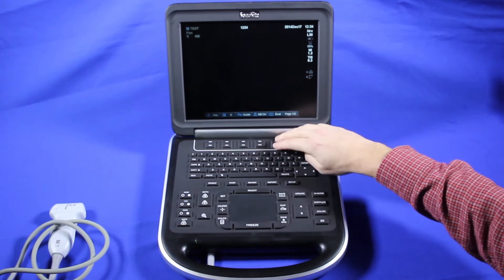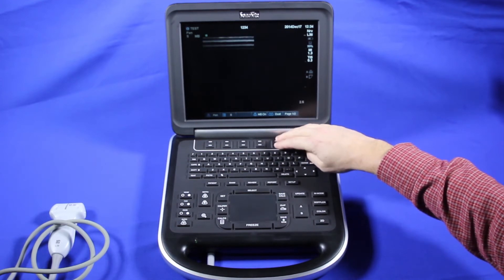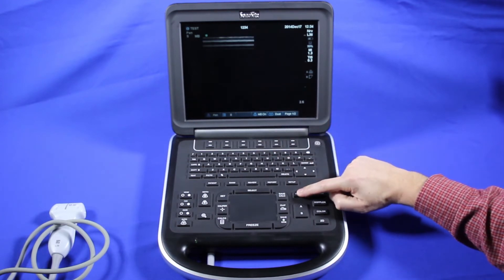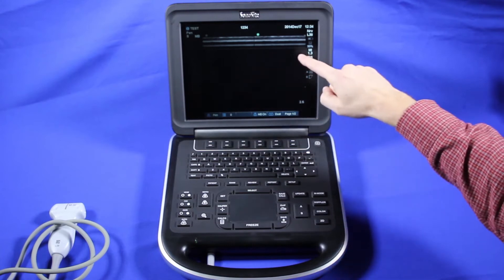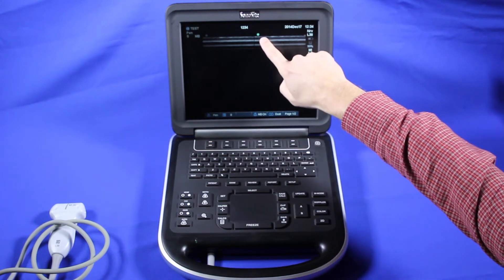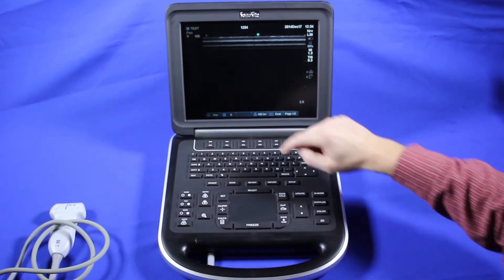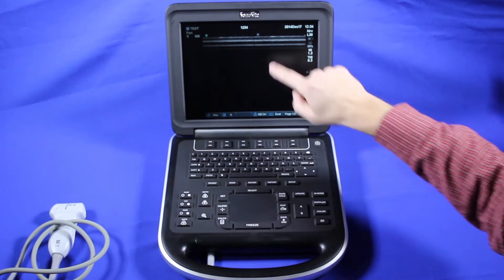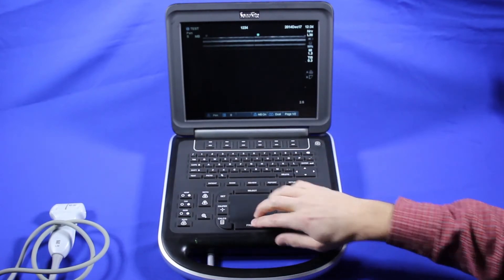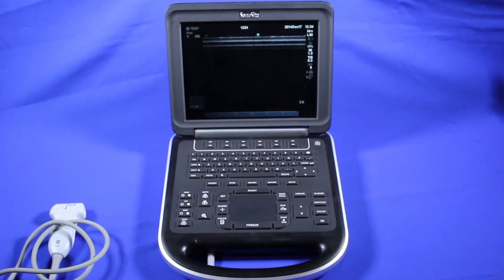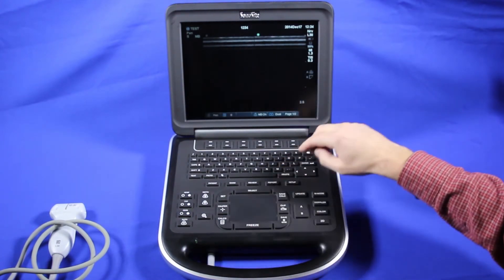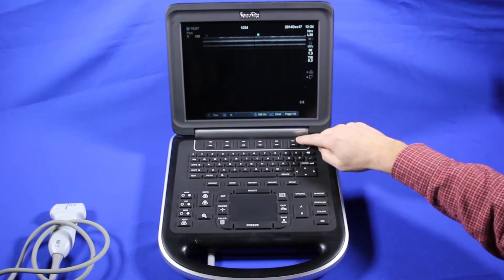Dual is for dual imaging. You would hit dual, then hit update to update the different image. This marker here will show you which image you're on. Go back and forth with the update key, and you can freeze.